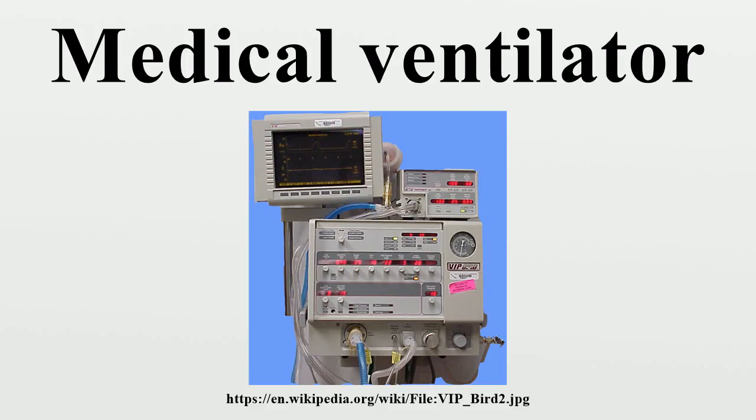In 1952, Roger Manley of the Westminster Hospital, London, developed a ventilator which was entirely gas-driven, and became the most popular model used in Europe. It was an elegant design, and became a great favorite with European anaesthetists for 4 decades. Prior to the introduction of models controlled by electronics, it was independent of electrical power, and caused no explosion hazard.